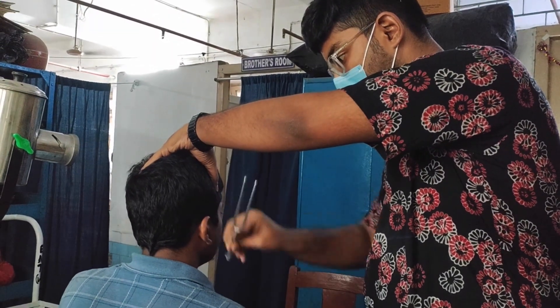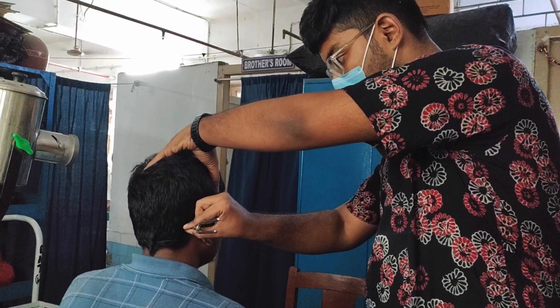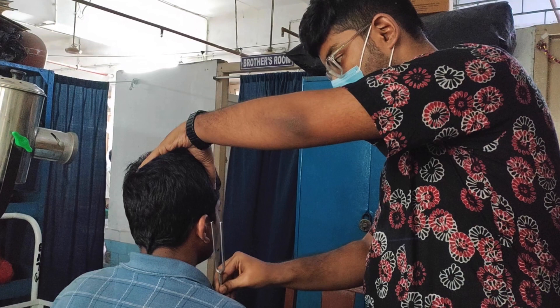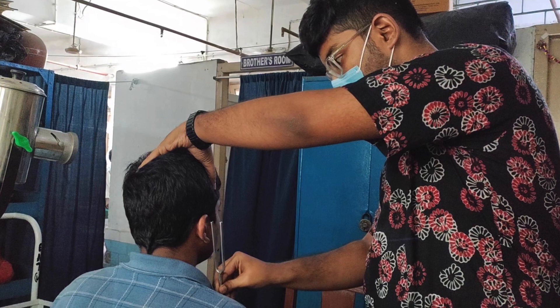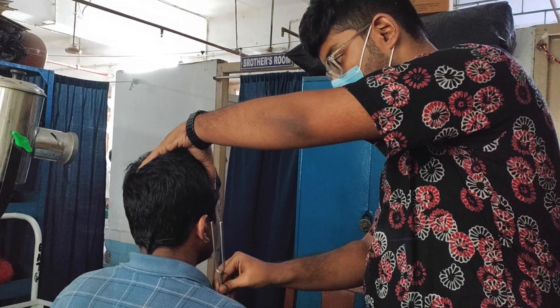Now let's talk about the findings you normally get in a Rinne's test. When we place the tuning fork on the patient's mastoid, it is basically measuring bone conduction. After that, we place the tuning fork in front of the external auditory canal opening. If the patient can hear the vibrations when we bring the tuning fork in front near the external auditory canal, it means that the air conduction is more than the bone conduction, which is termed a Rinne positive ear.